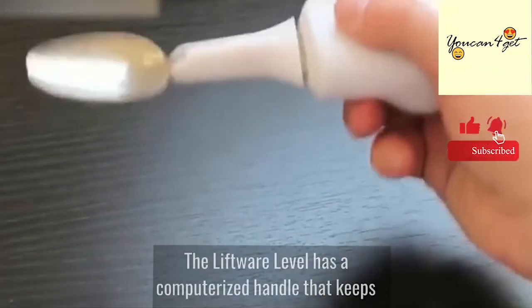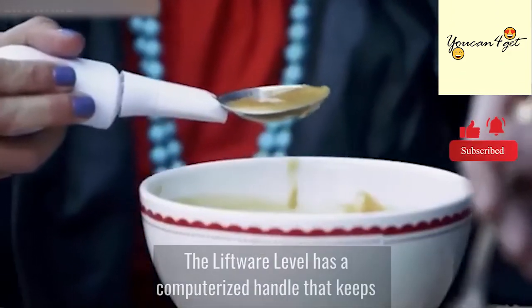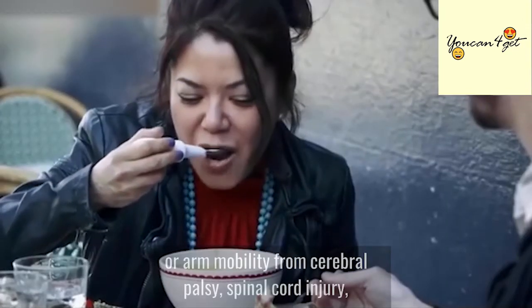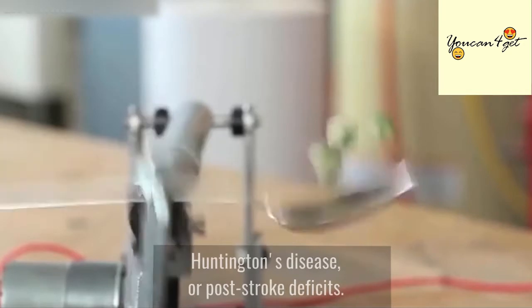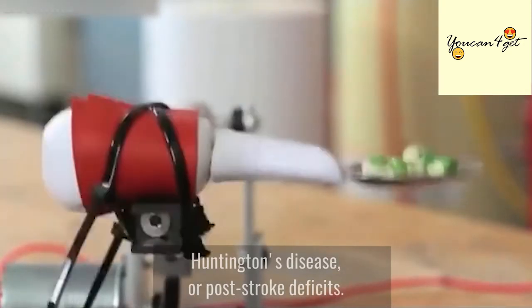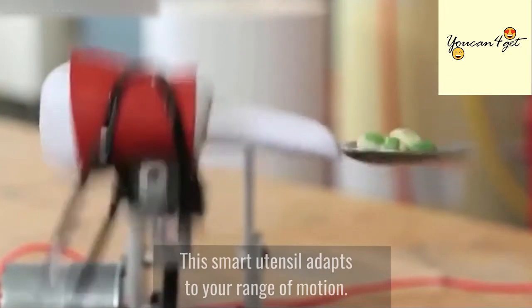The Liftware Level has a computerized handle that keeps its attachments level for those with limited hand or arm mobility from cerebral palsy, spinal cord injury, Huntington's disease, or post-stroke deficits. This smart utensil adapts to your range of motion.